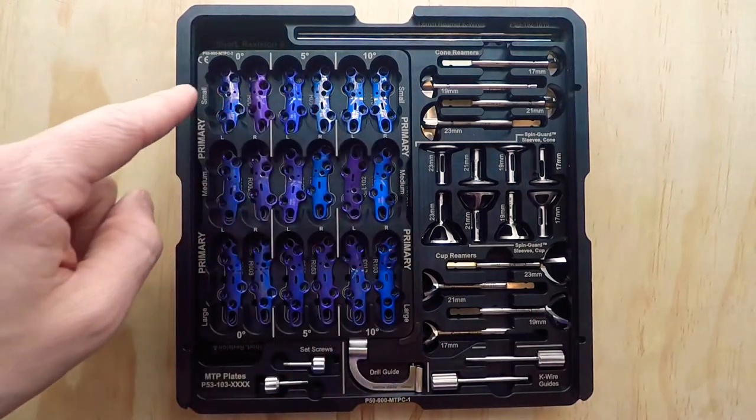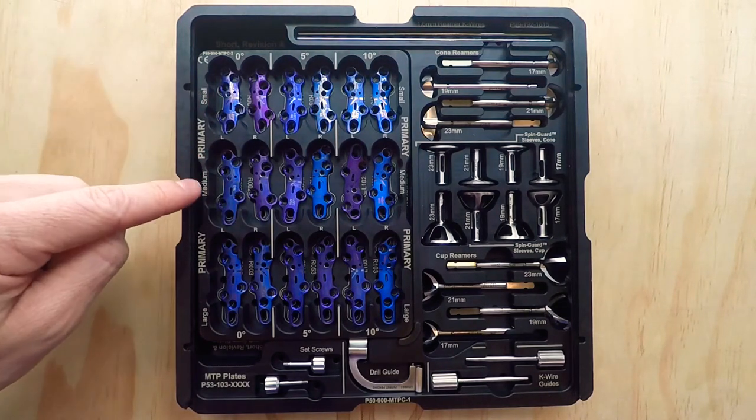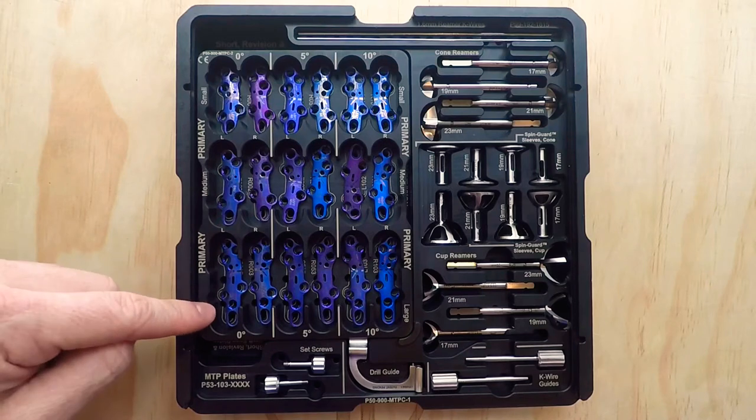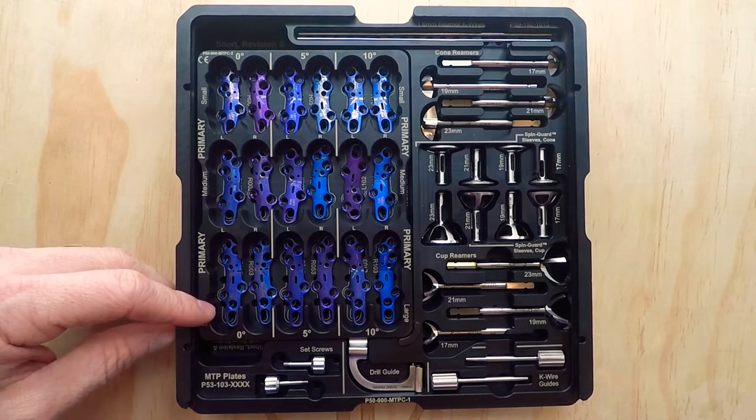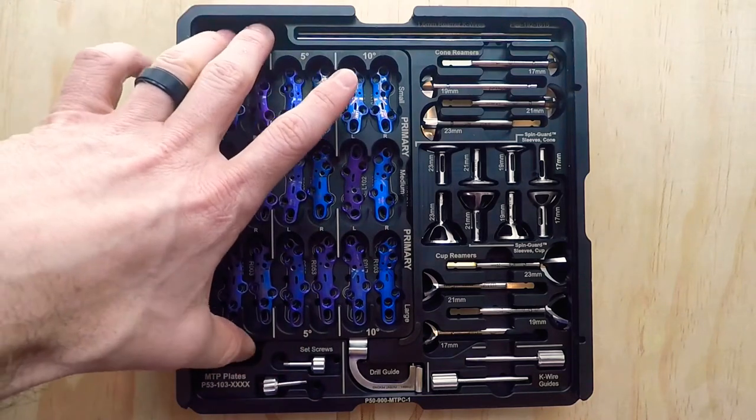This top region here — these are our primary MTP plates. We have a small, medium, and large length offering in our primary plates. They are offered in 0, 5, and 10 degrees of dorsiflexion.